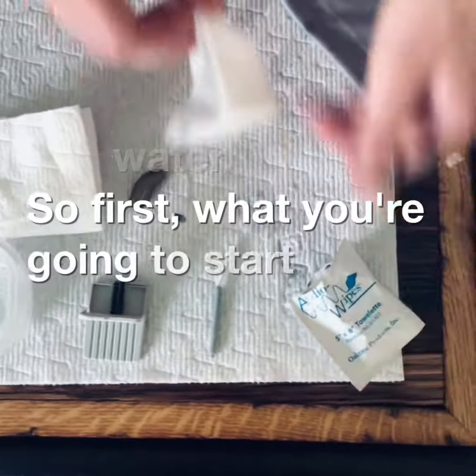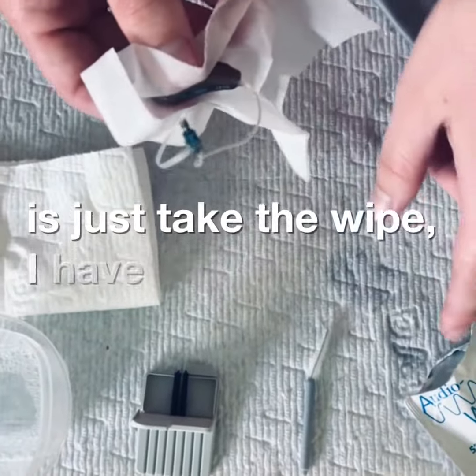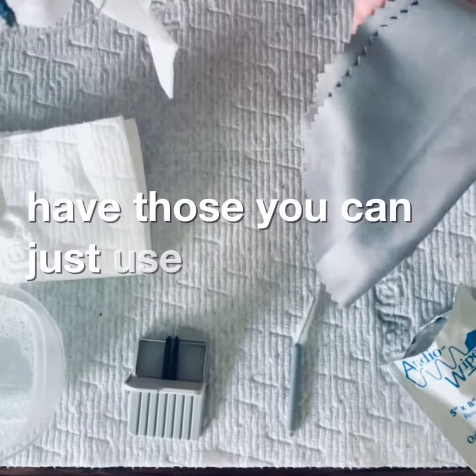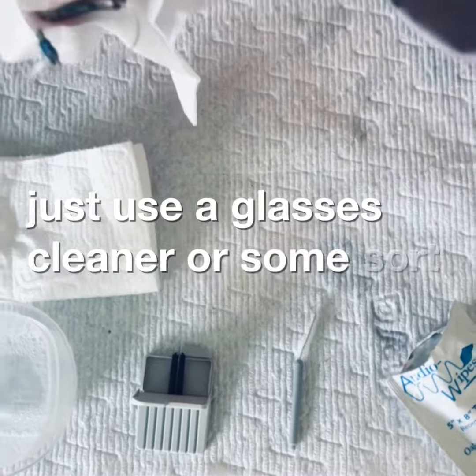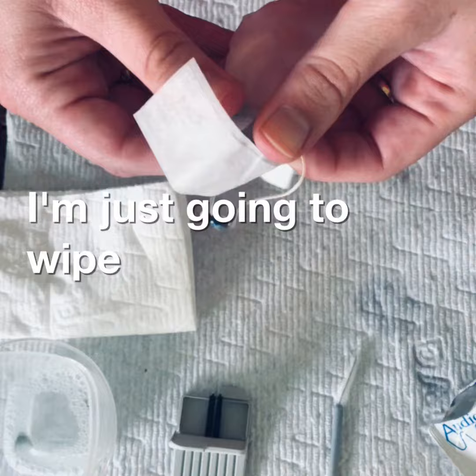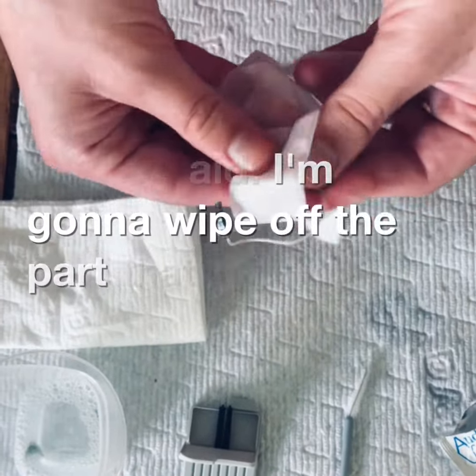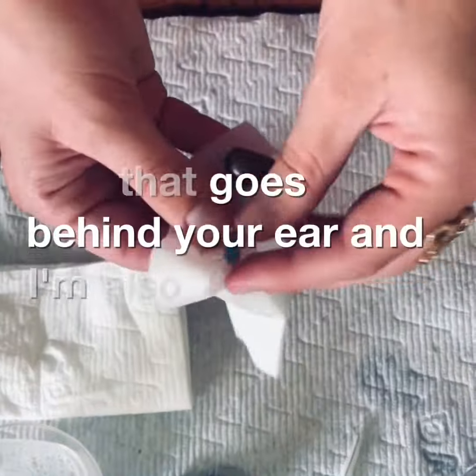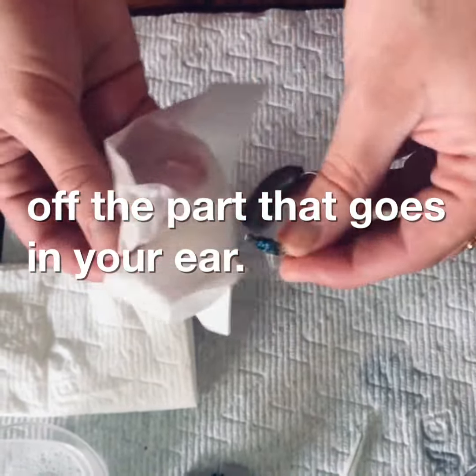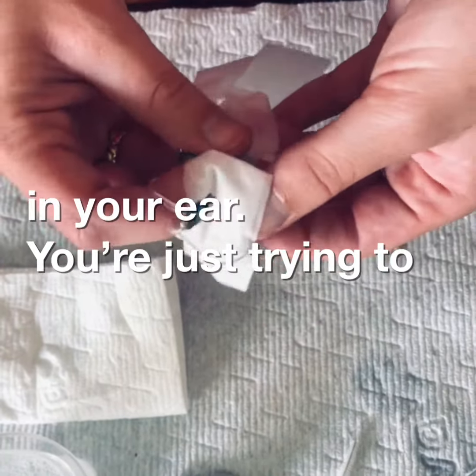First, you're going to start by taking the wipe — I have audio wipes here. If you don't have those, you can use a glasses cleaner or some sort of lint-free object. Just wipe off all around the hearing aid, the part that goes behind your ear and the part that goes in your ear.